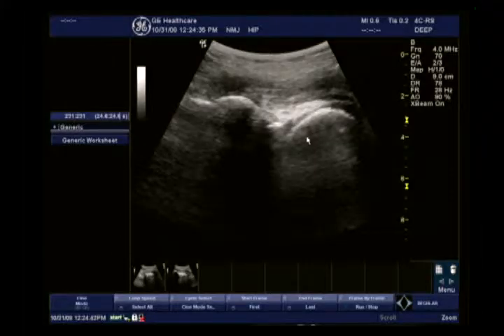One of the nice things about ultrasound is performing needle guidance. If I had a patient that I wanted to administer medication to, I can easily look at the ultrasound image and know that I need to be about 3.5 centimeters down to administer medication directly into the joint space. You don't want to be above the capsule or lateral or medial to that, but using ultrasound guidance, you're able to direct the needle directly to the point of interest.